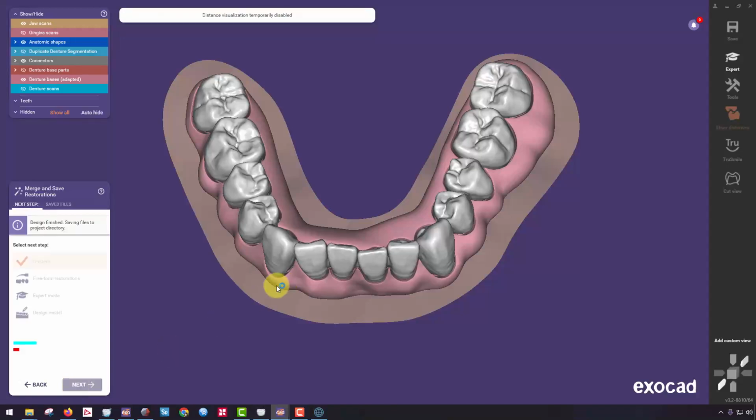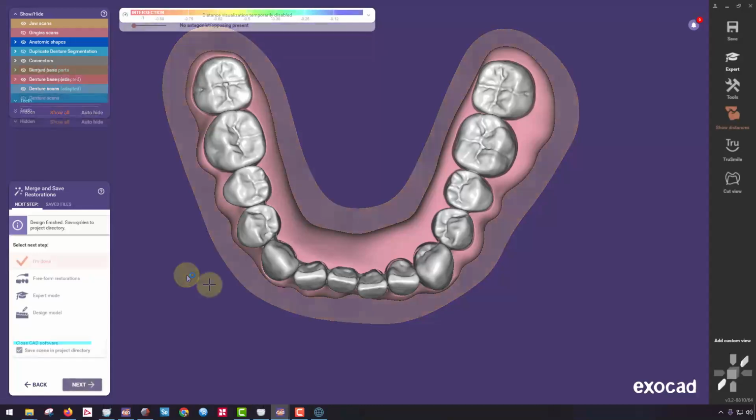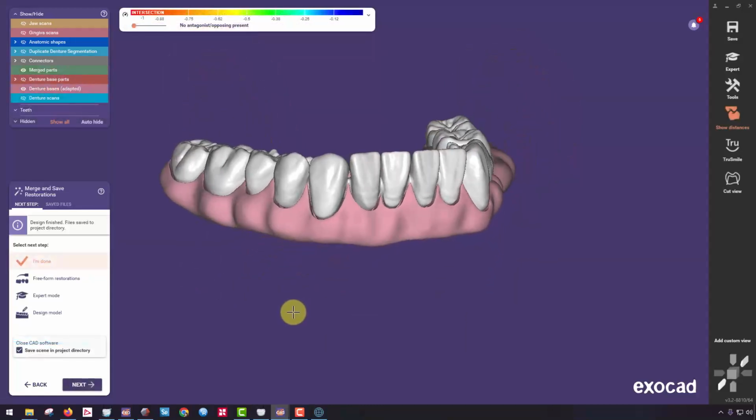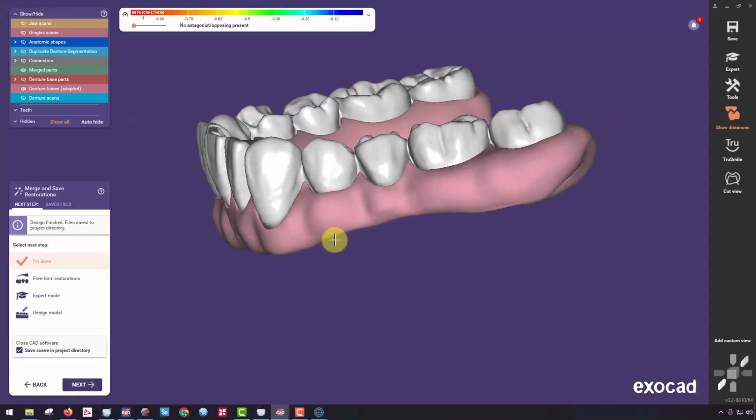Now this is really where the magic occurs, when it merges everything together. So it's going to go ahead and create your final printable or millable restorations and STL files from this particular stage where it cleans everything up. So here's my finished files. Now I'll go ahead and take a look at these. Overall, this does look pretty good, everybody.